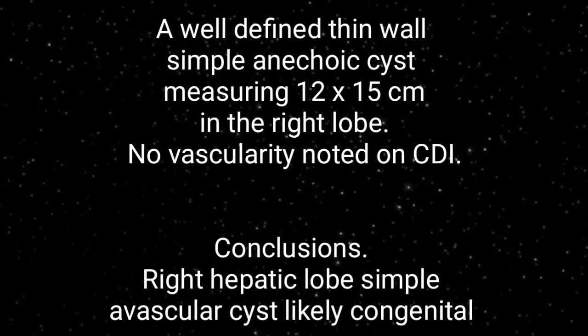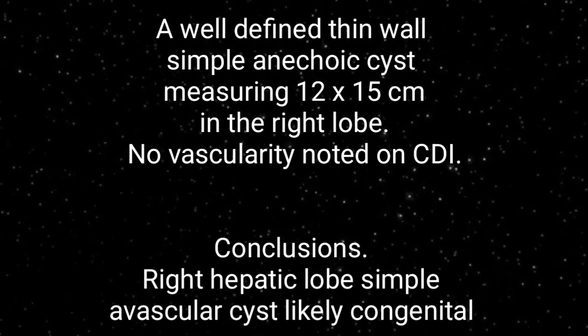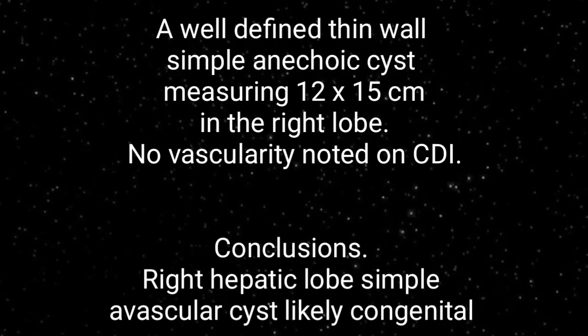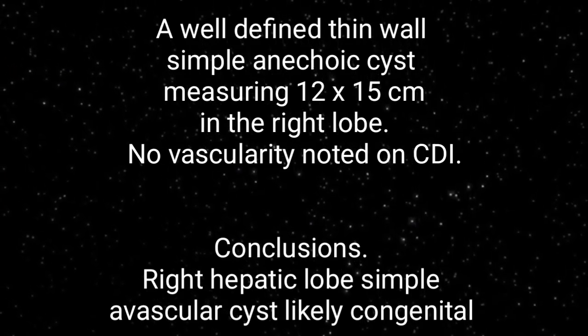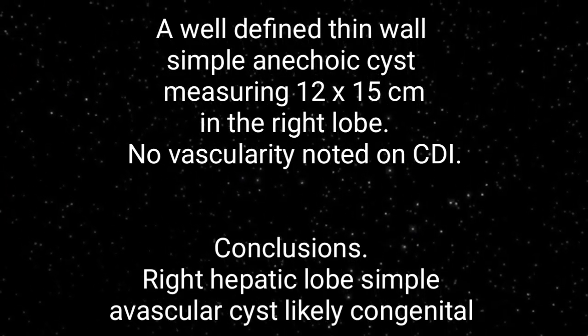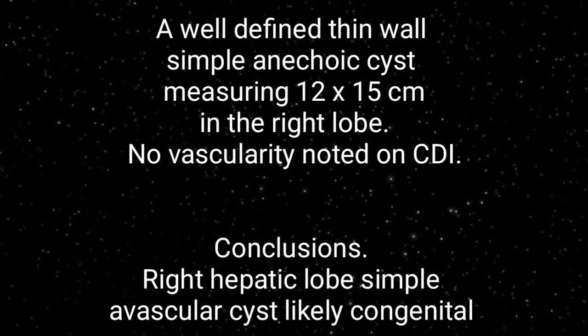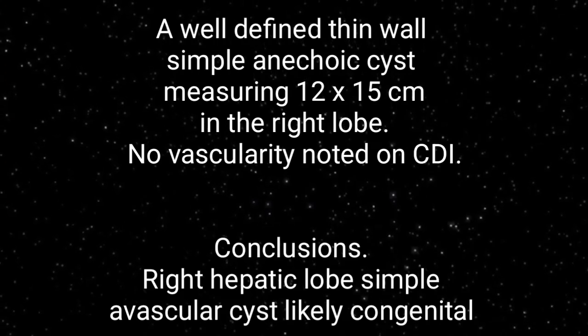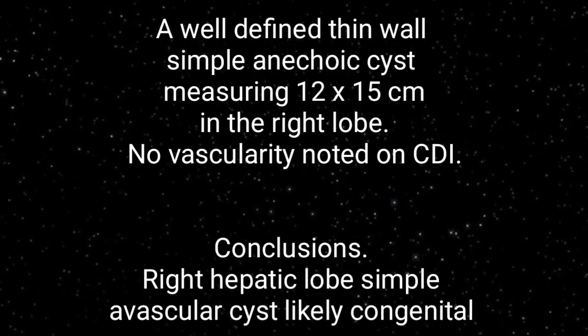In the conclusion, mention that right hepatic lobe simple avascular cyst, likely congenital. So it contains all the information: size, its structure and its location, and you have also concluded with a proper diagnosis that it is a likely congenital cyst.